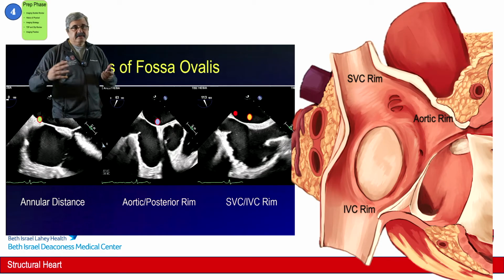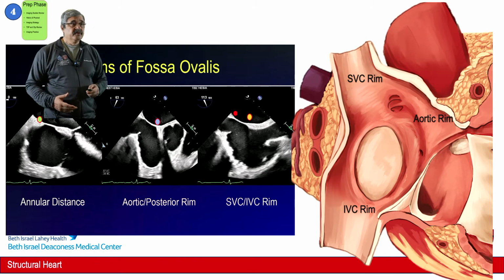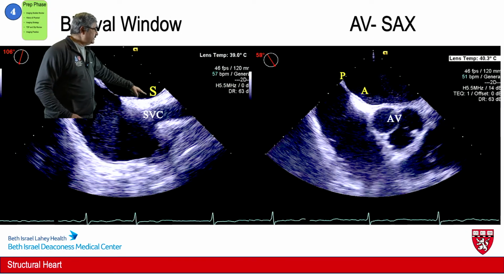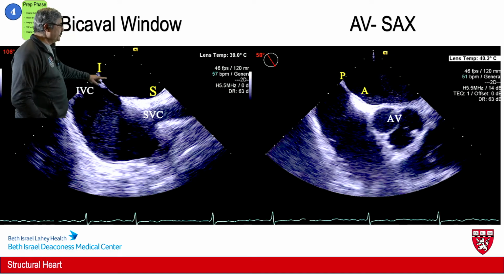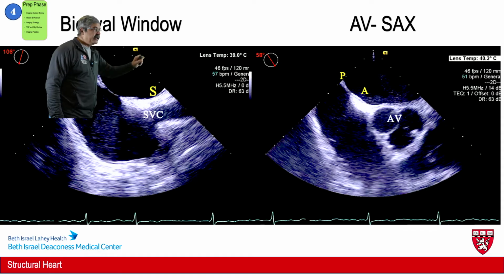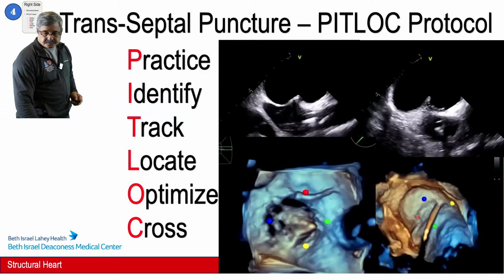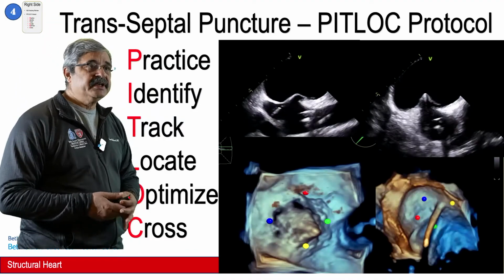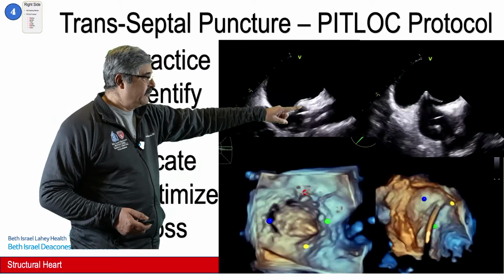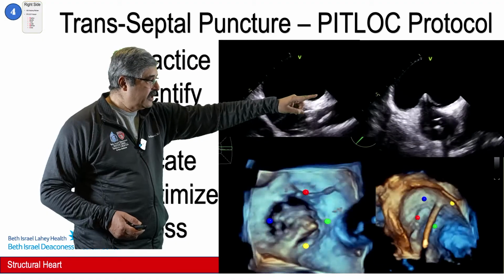So these are the four margins of the interatrial septum that we need to display for our cardiologist to look at. Superiorly, we have the SVC here and the IVC, the superior and inferior. And over there, we have the aortic valve, which demonstrates the anterior, and then we have the posterior margin right next to it. So in this video, in the upper left video over here, we have identified and tracked the transseptal puncture needle to the fossa ovalis. We have tented and located it.